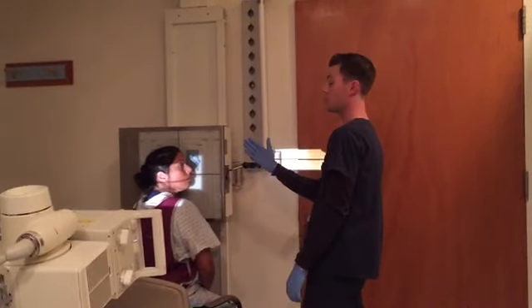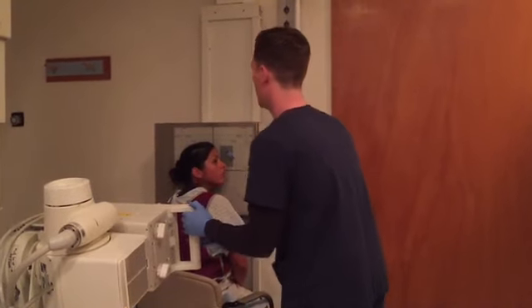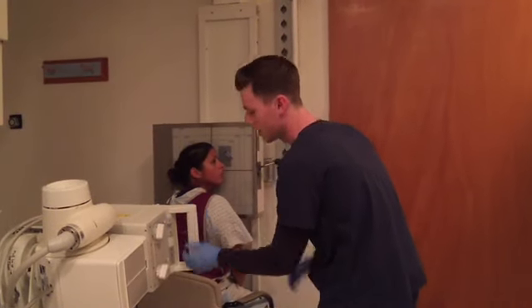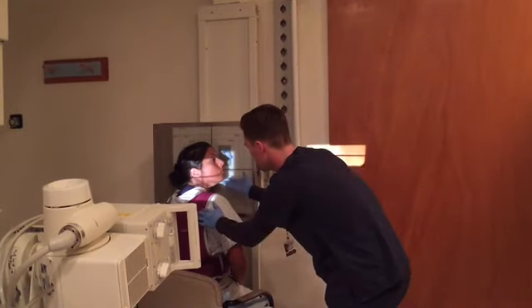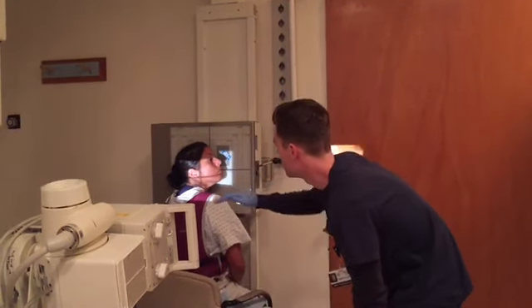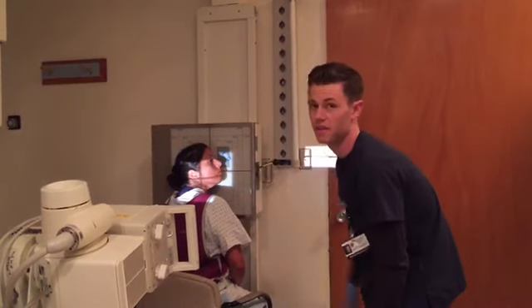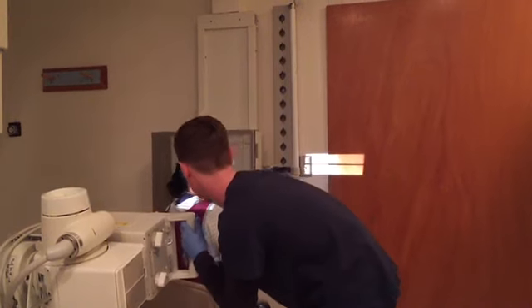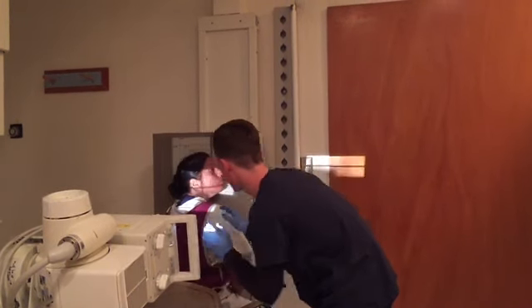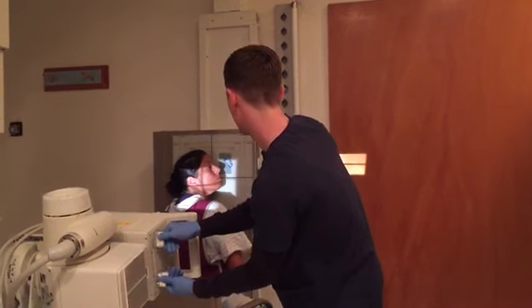I want the mid-sagittal plane to be parallel with the IR and the interpupillary line perpendicular. And you want the patient to extend their chin out so that the long axis of the mandible is parallel with the transverse axis of the bucky. So right about there. Actually, lean back for me just slightly. Right there. Perfect. And cone down.